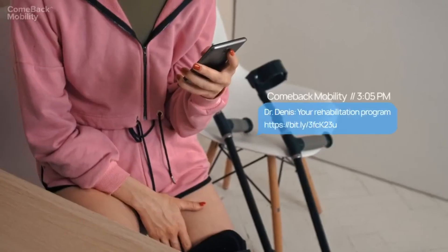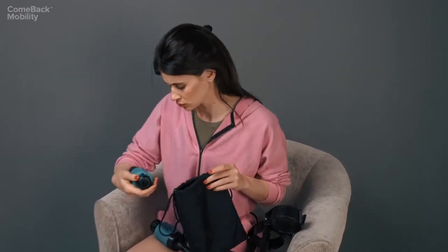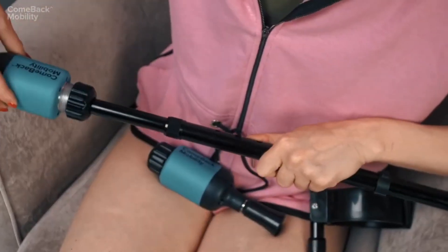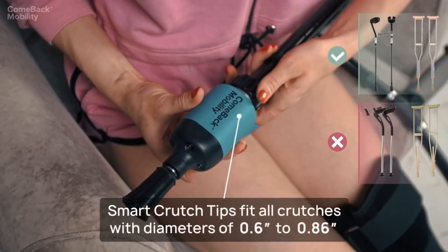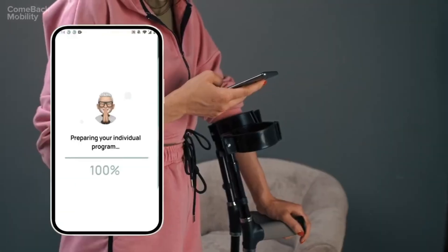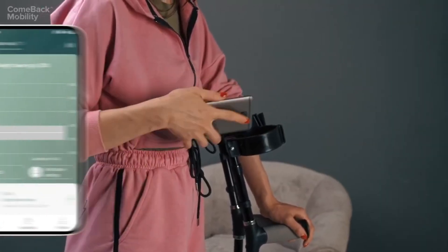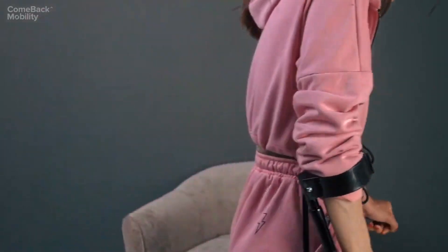The patient receives a link to the program and opens it up in the patient app. Following instructions, the patient installs the Smart Crutch Tips and syncs them to the app via Bluetooth. After pairing the devices, the specific weight-bearing program is activated — now stored in the patient's phone and in the Smart Crutch Tips.